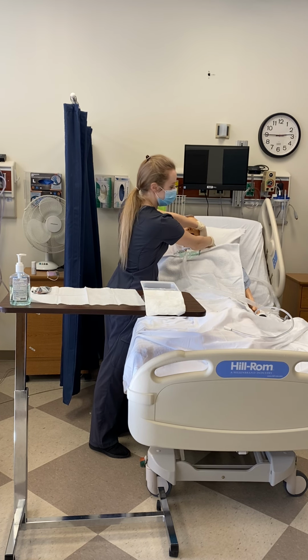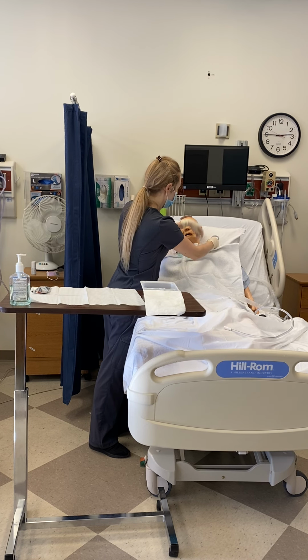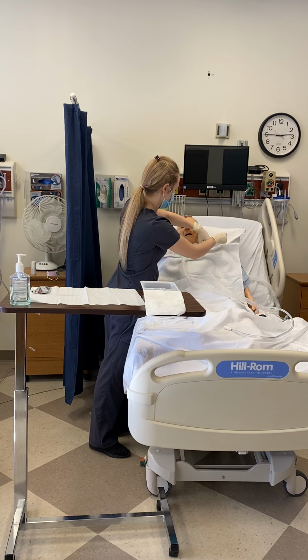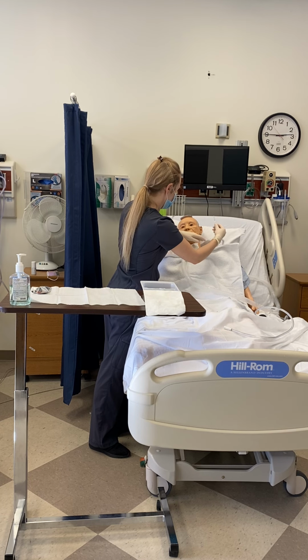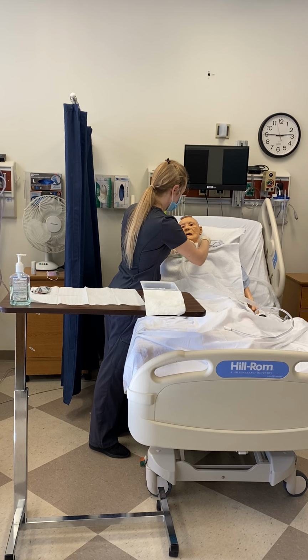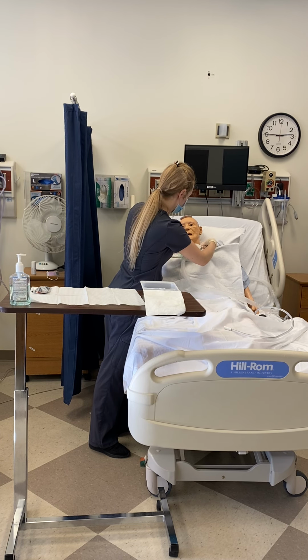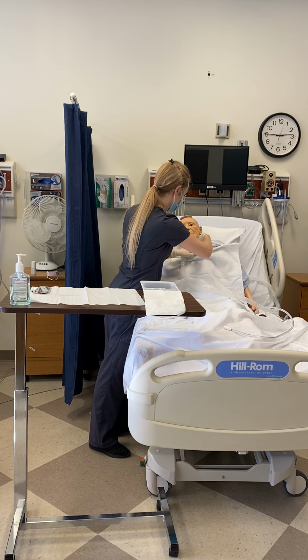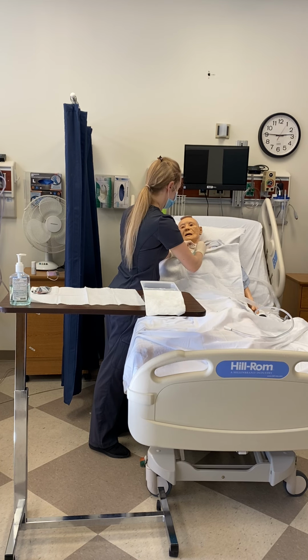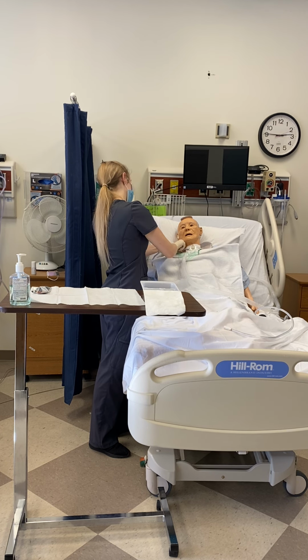Again, I would normally want somebody to help me with this, but I will just undo one side at a time. And then undo the other side.